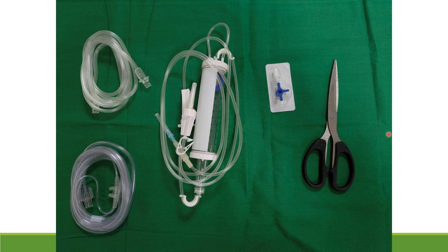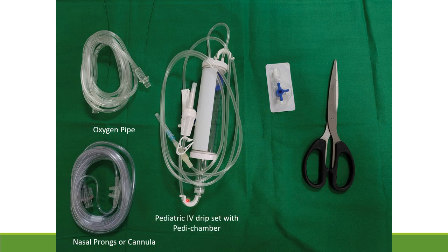What things do we need for making our indigenous CPAP arrangement? We need nasal prongs of appropriate size or a nasal cannula. Second, we need an oxygen pipe. Third, we need a pediatric IV drip set with pedi chamber. Next, we need a three-way stopcock, a pair of scissors, and of course an oxygen source — preferably central oxygen supply, though an oxygen cylinder or oxygen concentrator can also be used.